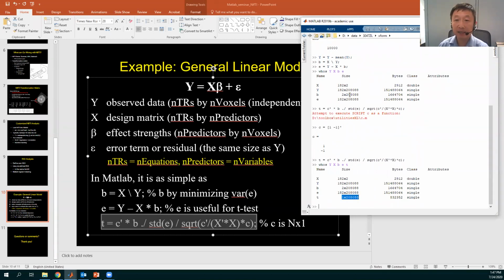So basically, it's the difference between the first and the second for each voxel. The voxels are always independent. So now let's quickly create a result. I'm going to call it result.